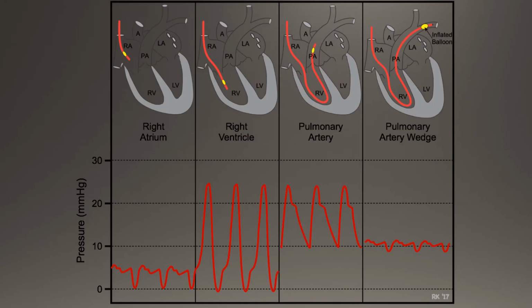So all of that is great for testing purposes, but what if you're in the hospital, the back of an ambulance, or an aircraft with this patient? Sure, you can get all of your numbers from the screen, but what about the wedge pressure? The vast majority of patients only get a wedge pressure upon initial insertion of the catheter. The reason being is that every time you inflate the balloon in the pulmonary artery to obtain the wedge, you're putting pressures on the wall of the pulmonary artery. For anyone that's ever had an anatomy class where you actually get to lay your hands on a heart, the pulmonary artery really isn't much thicker than tissue paper, so it's best not to wedge.